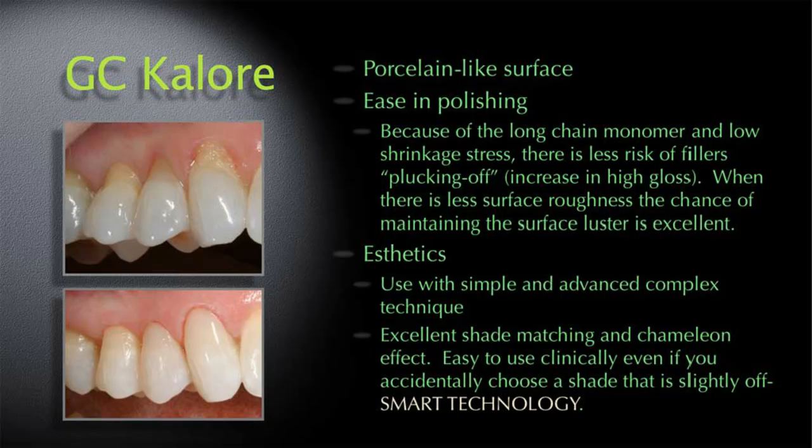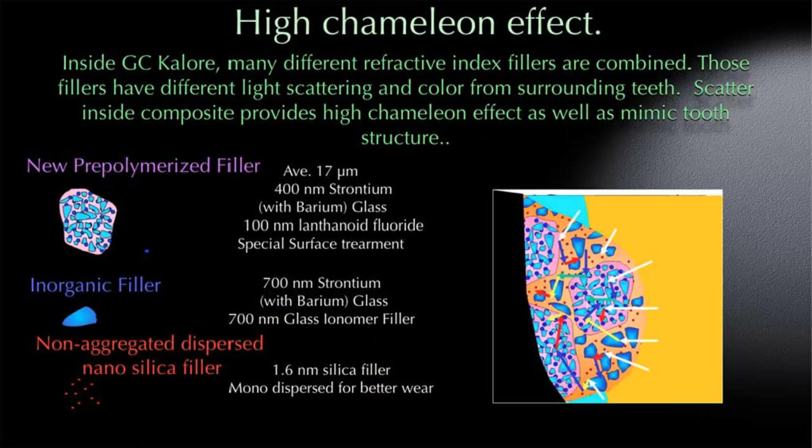And of course, the shade matching and chameleon effects are tremendous as it relates to this. The chameleon effect is basically using different refractive index fillers combined in such a way that it is reflecting, refracting, and absorbing light at different rates that is similar to teeth. And so when you have it restored in a surrounding tooth structure, it will scatter the light in a very natural way, thereby creating what has been called the chameleon effect.